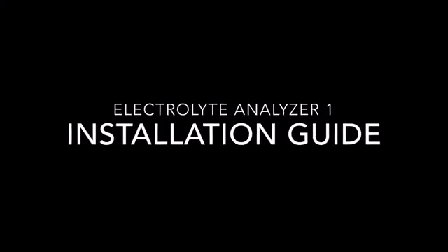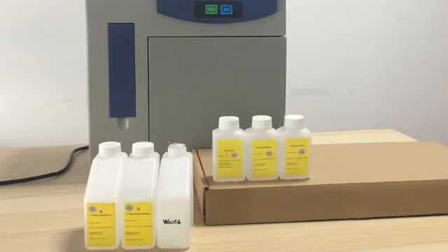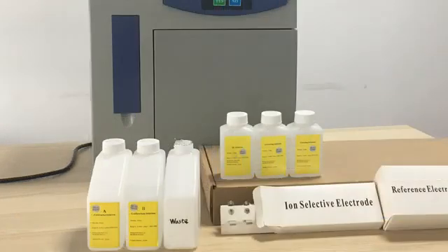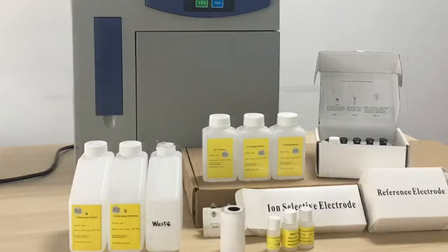Electrolyte analyzer installation guide. First, we put the machine and the accessory box on the table, then take out the reagent calibration A and B, the QC solution, activating and cleaning solution, the electrodes, the cleaning set, and the internal electrode solution.